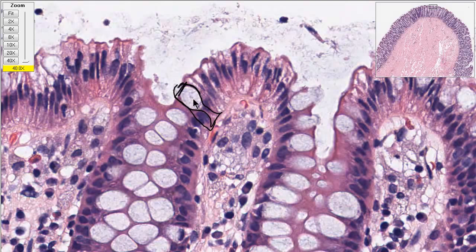So this is mucus, the term for either the overall structure or the material that's elaborated up here. Chemically, it's something called mucin. What mucin is, it's almost like the goo runners eat, where it's just a lot of sugar holding a lot of water.